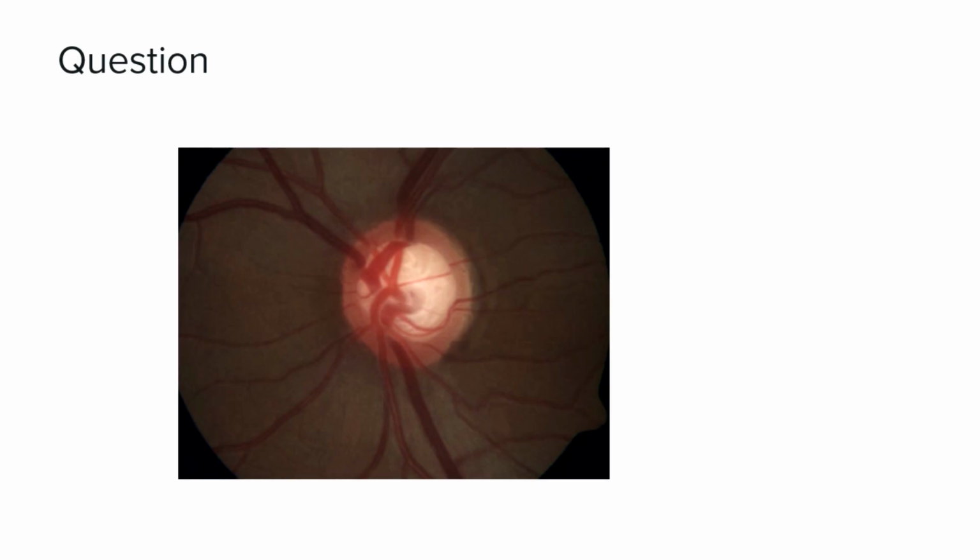This size is average. Ma'am, then the second point would be neuroretinal rim. So here we see that the rule is followed because inferiorly it is the most, then superiorly, then nasal, then the temporal. The neuroretinal rim is healthy. Then ma'am, the third point, retinal hemorrhages. If we have to see, there are none.